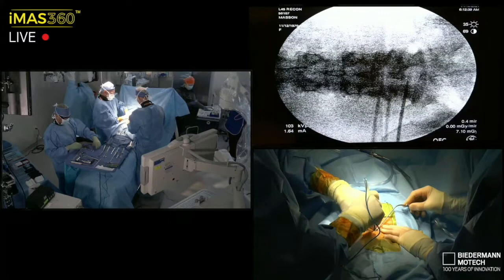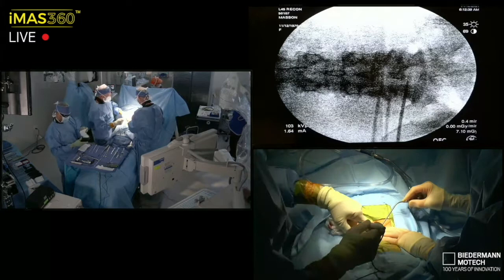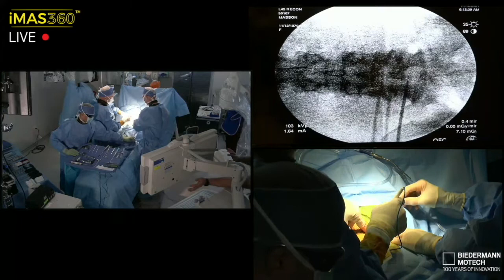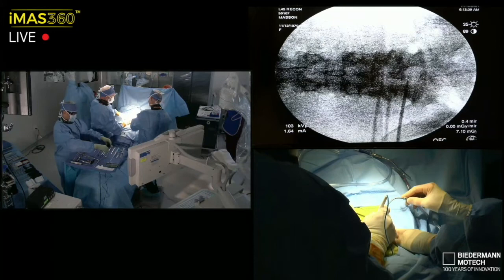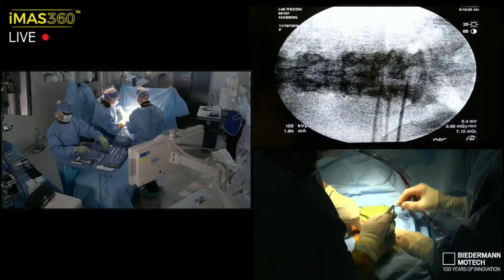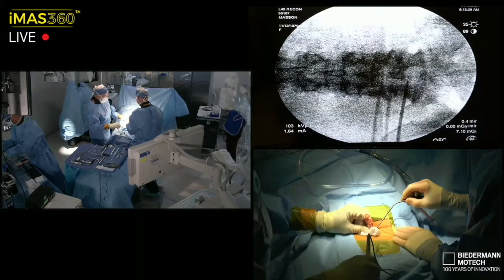We'll basically just strip and split the muscle to expose lateral mass L4 to L5, and that's it on the right. On the left, I'm going to extend it a little bit more. That's going to get me all the way down to L5-S1 for the foraminotomy. But I don't want to plunge deep into that hemilaminotomy defect. I'll do that under the scope. There's definitely scar tissue here, as expected. All right, let's get the scope in.